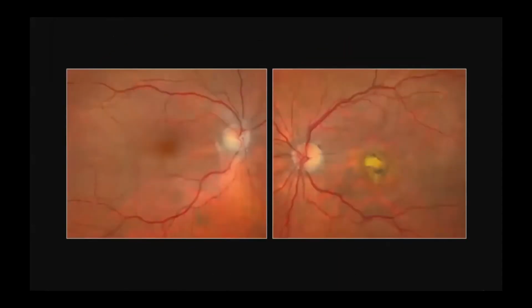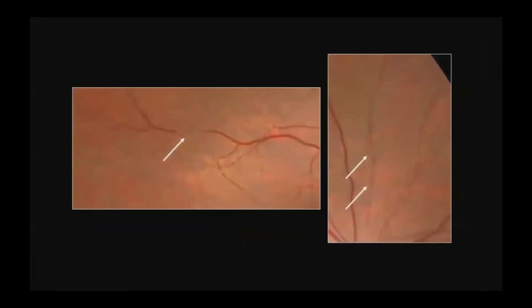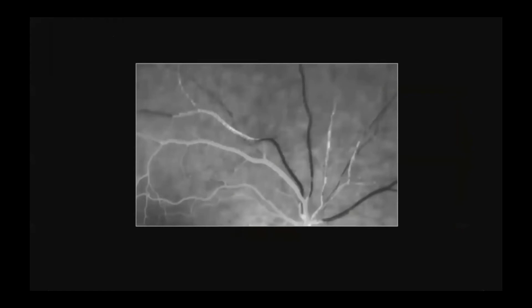Looking at the imaging, in the left eye, you can see that there is subretinal fibrosis, consistent with her end-stage wet macular degeneration. In the right eye, the findings are slightly more subtle, though you can appreciate some mild optic nerve pallor here. It's really in the peripheral scans that we can see the vascular changes that are the hallmark of this disease. And especially on angiography, we can see boxcar segmentation with slow segmental blood flow through the arteries that characterize an arterial occlusion.